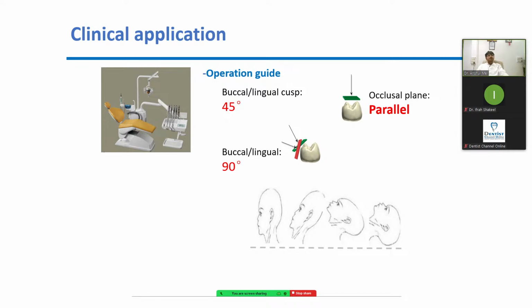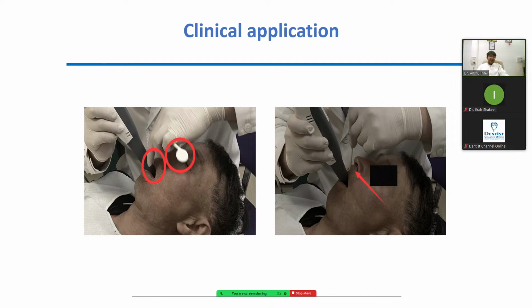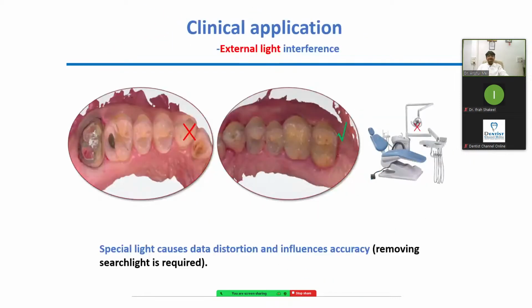So this is the easiest way to scan. You will get the image in one shot. Okay, so that's how we can do the scan. And yes, it's an indirect vision. So either you should be completely inside the patient's mouth with your assistant helping you, or you are completely outside and make sure you are not hurting the patient, because it's an indirect vision.